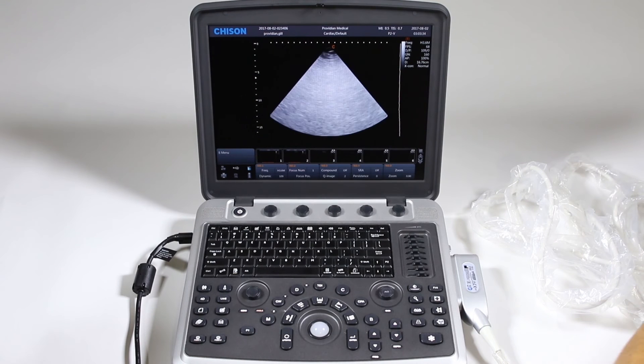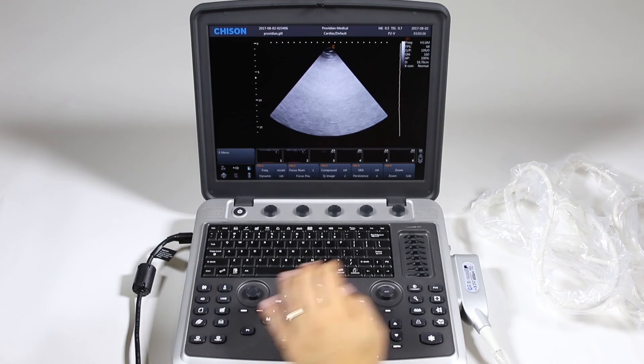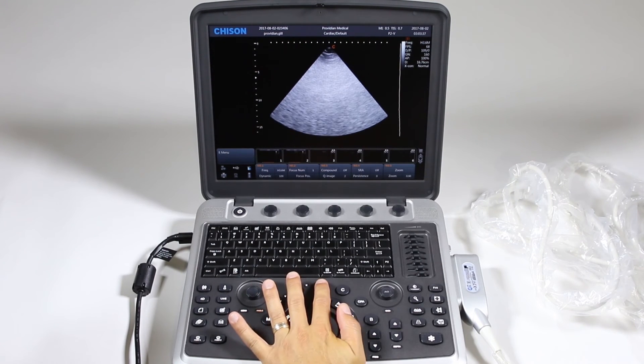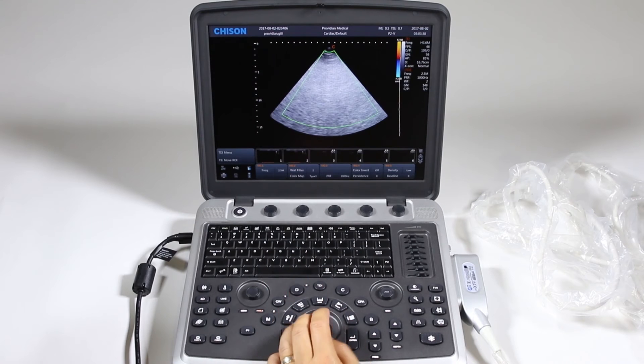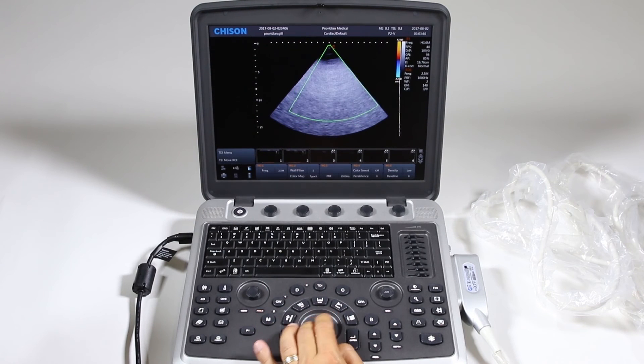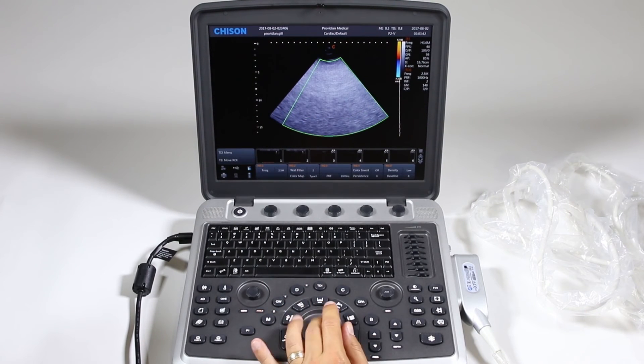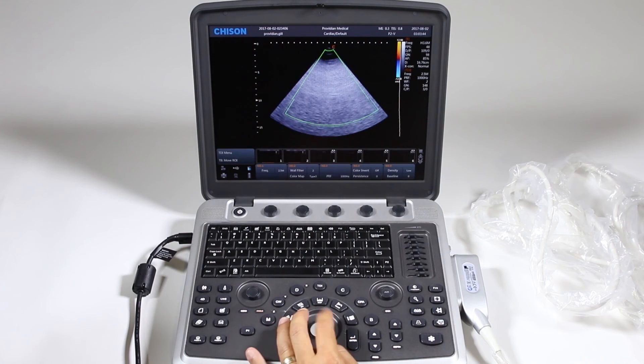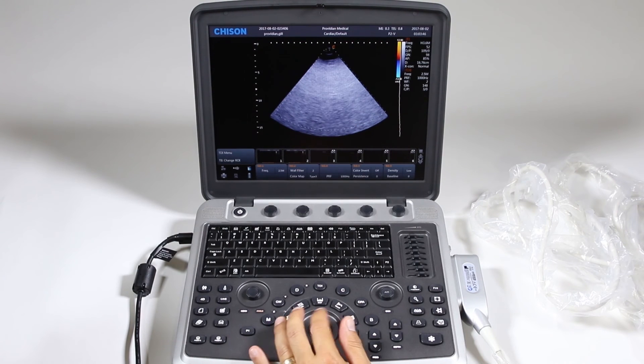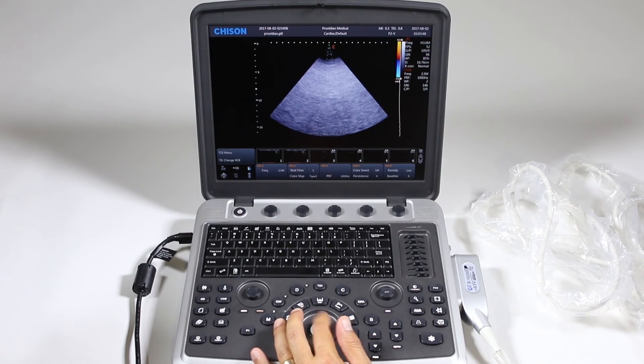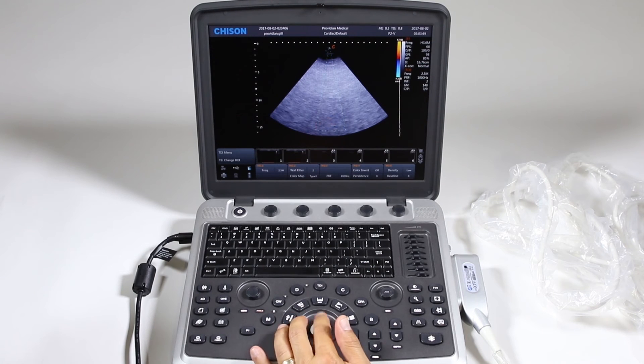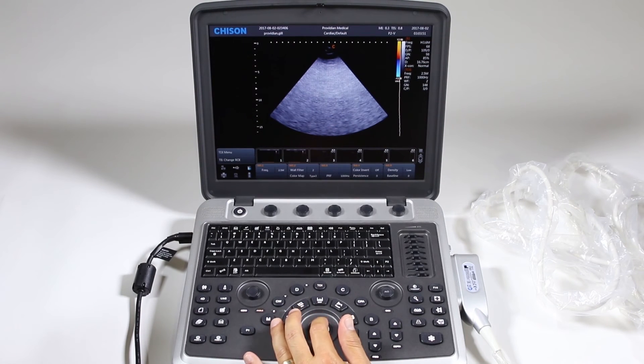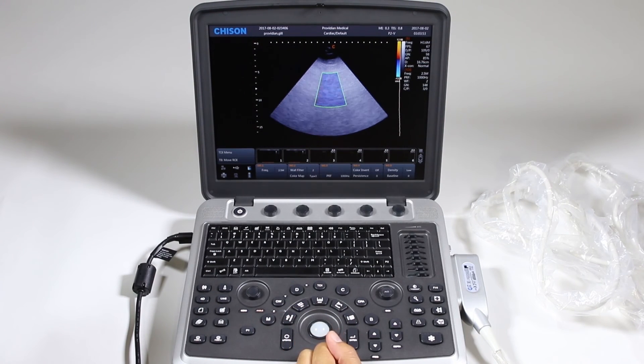And I'll start by doing tissue Doppler and that's simply done by pressing here and use the update key to change the position. Enter will change the width, update will change the depth. So I click enter.